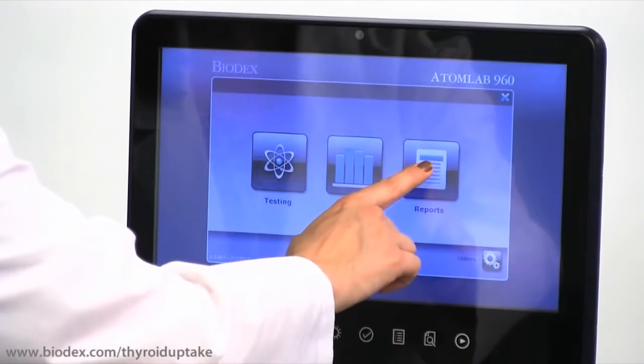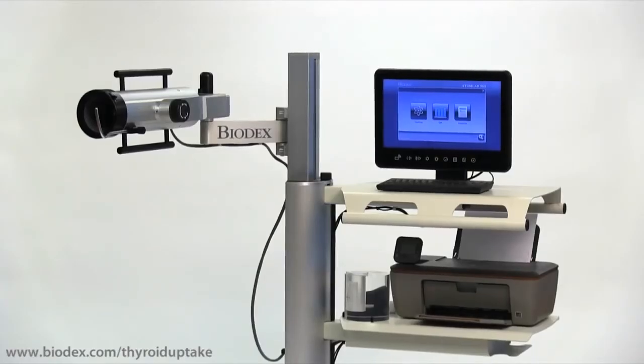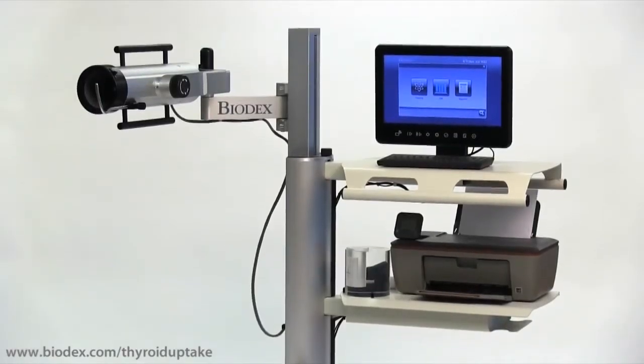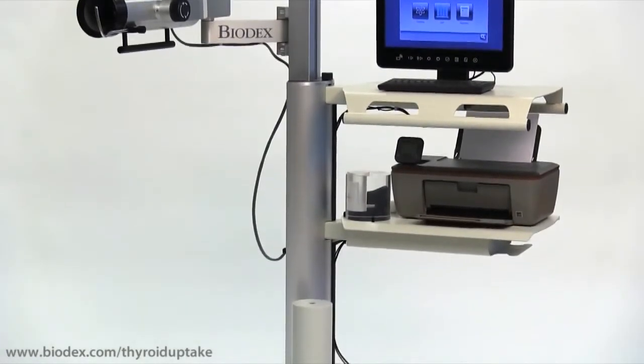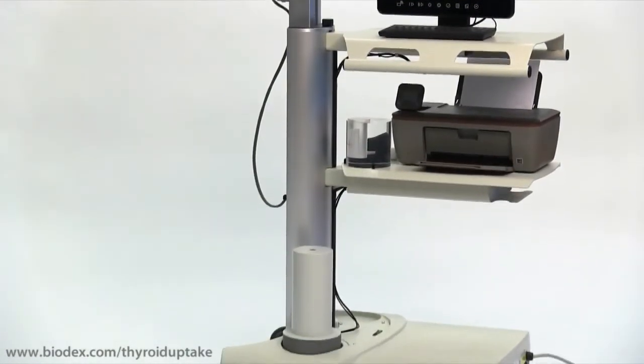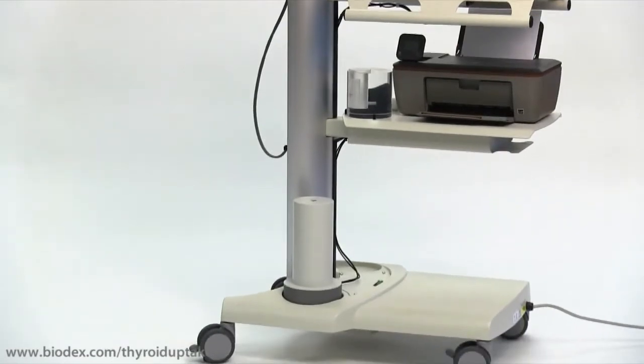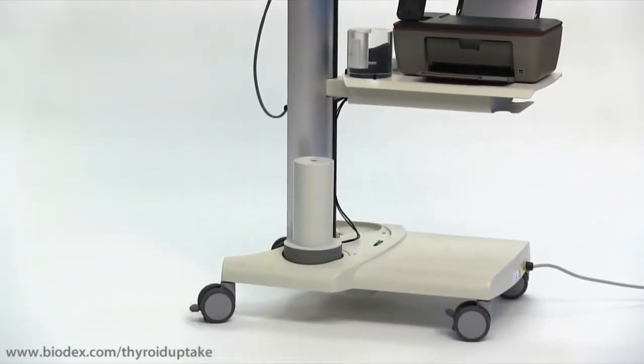The self-contained AtomLab 960 system is configured on a compact mobile platform with locking casters and a base that measures only 26 inches wide by 34 inches long.